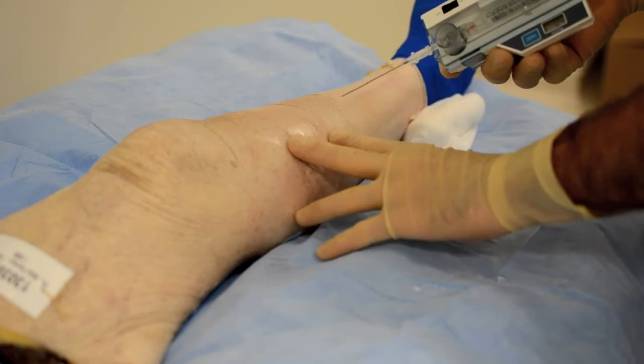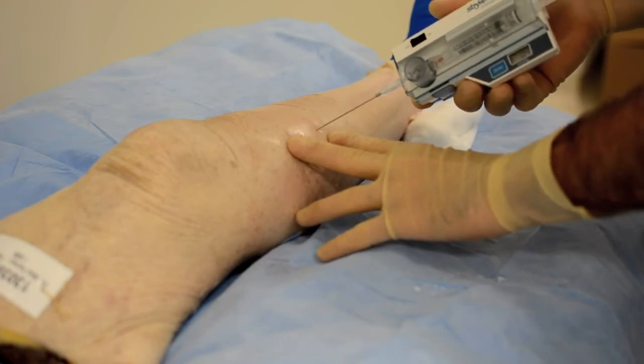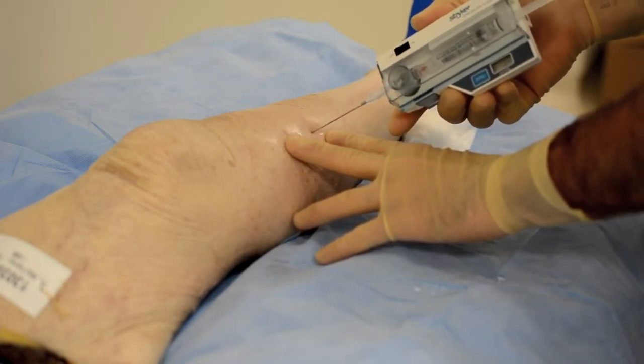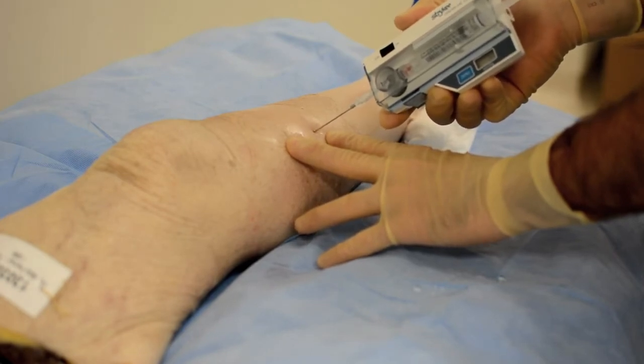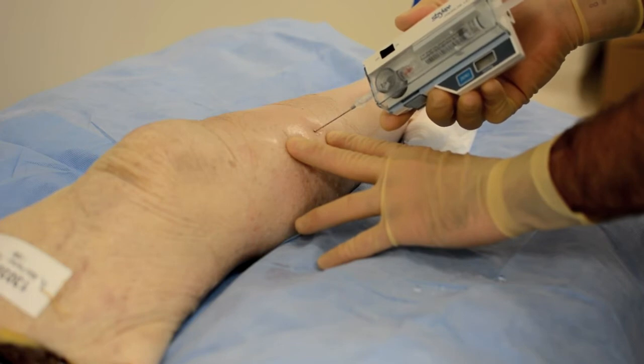You will maintain your angle of insertion to what you zeroed at and place the needle into the compartment. You should feel two areas of resistance or popping. One is the skin and dermis. The second should be the actual fascial compartment.